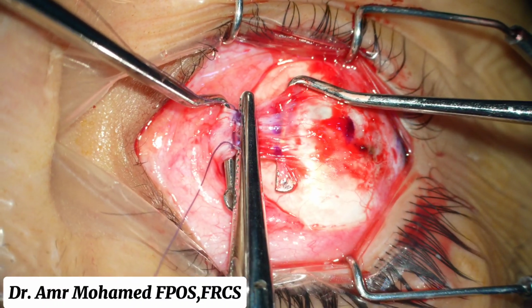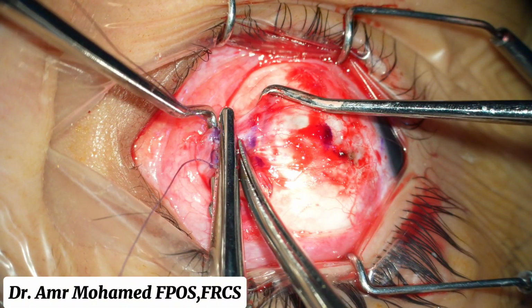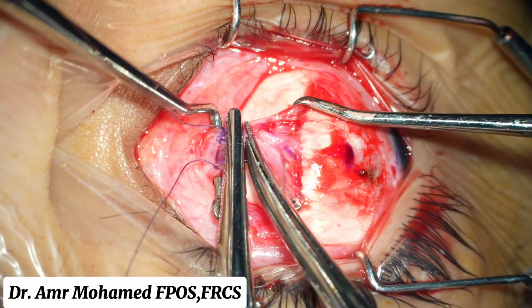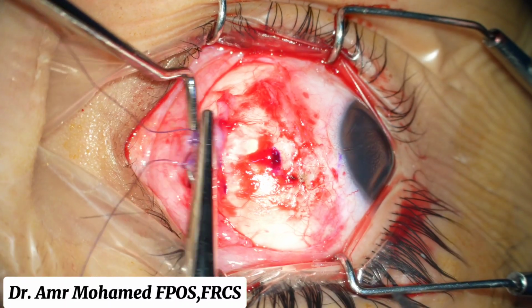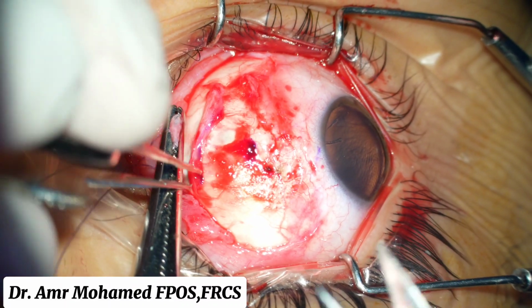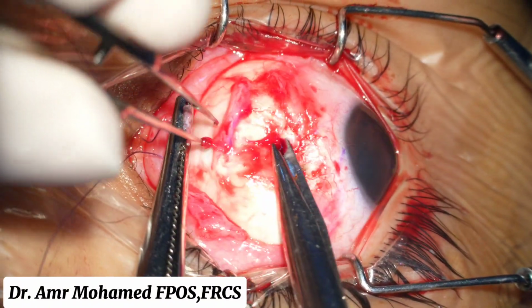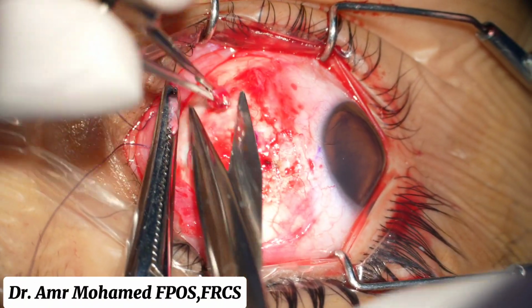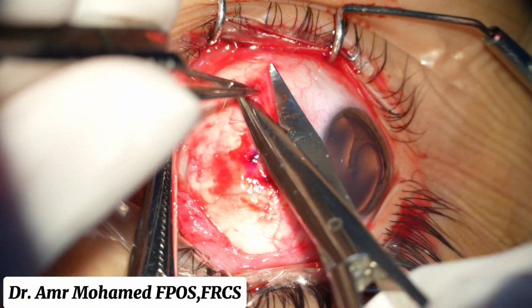After isolating the muscle using Vicryl 6-0 suture, I resected the pseudotendon part and I measured 5.5 millimeters from the limbus to advance the medial rectus to the original insertion.